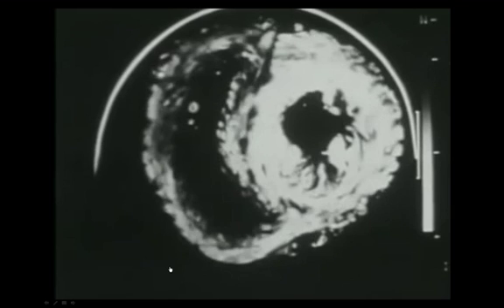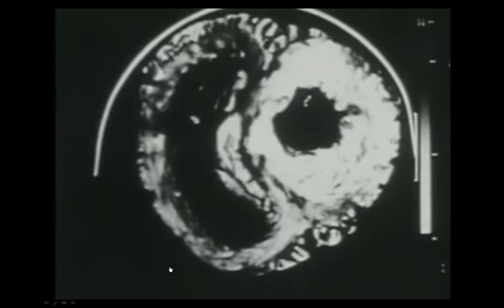Here is a part of that movie, and this is a bovine heart passed through a high speed CT, obviously, and it's inflated with air. But when it plays, you get the view of this external and internal reciprocating spiral of the fibers of the heart. It's very neat. This is part of the movie that lasts the 11 minutes.